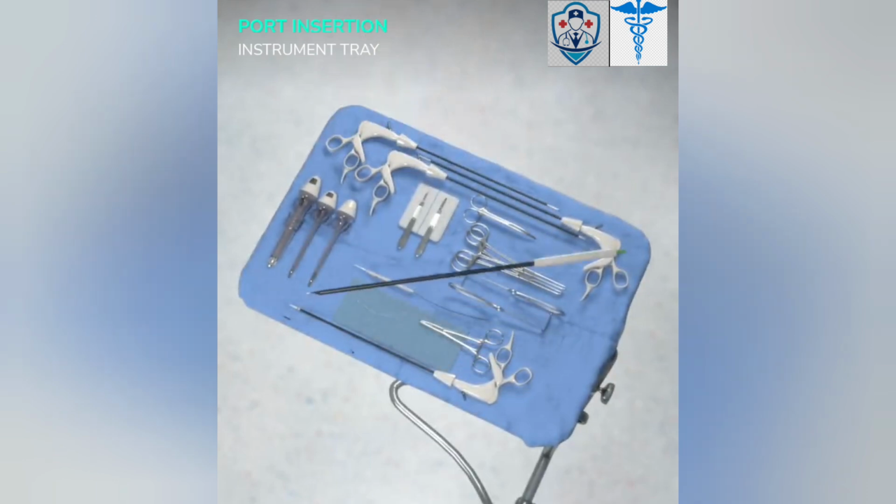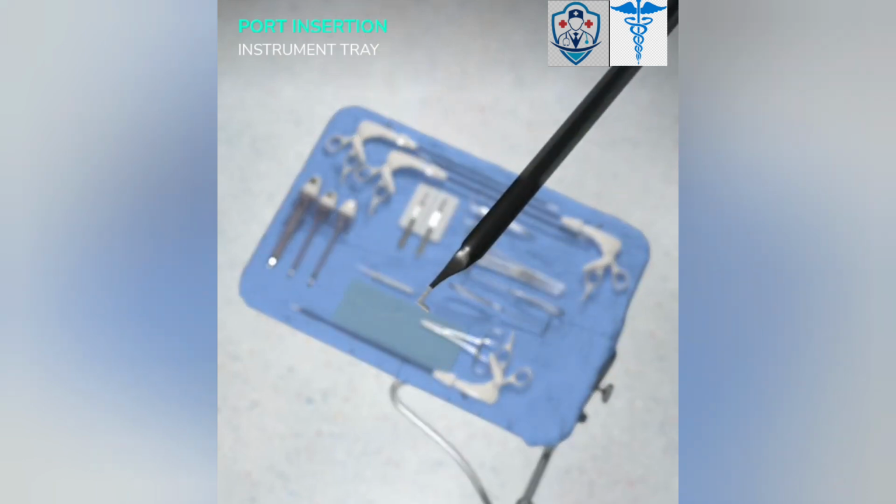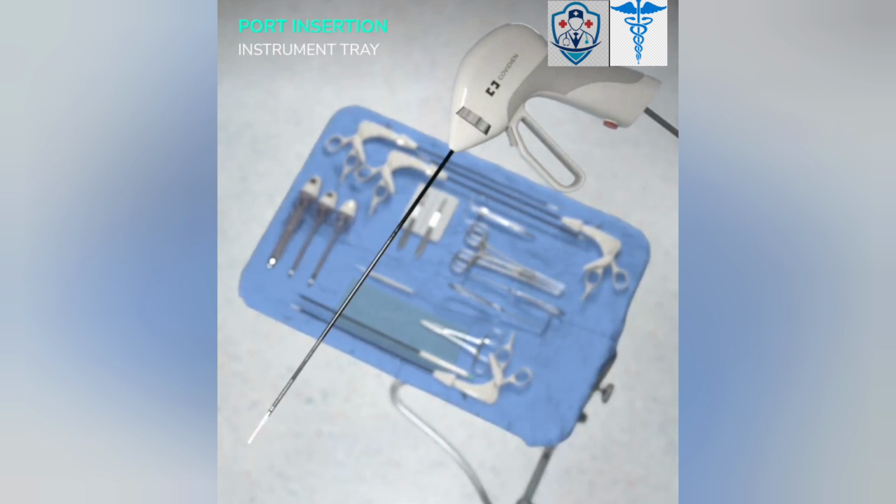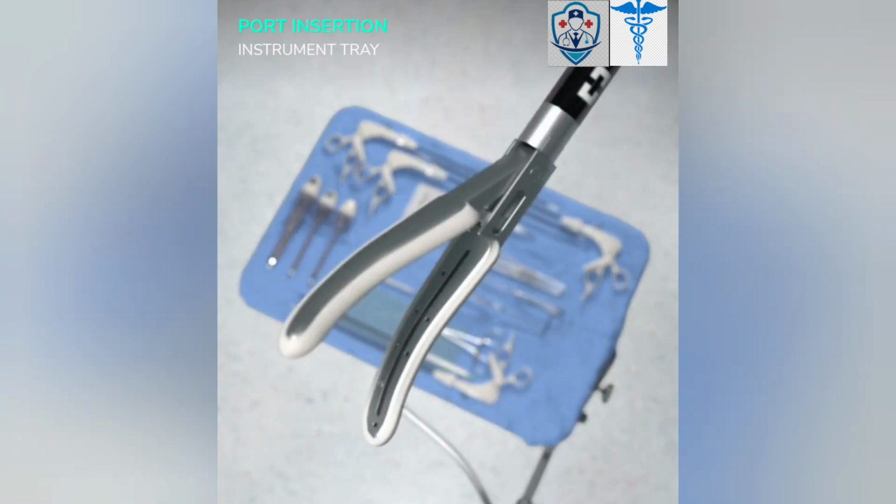The disposable hook has a right-angled tip. The hook can be used to cut or coagulate using different voltage outputs. This instrument is commonly used as the general dissection instrument in laparoscopic appendectomies. Another energy device can also be used as an optional instrument in this procedure, depending on the surgeon's preference to grasp, cut, dissect, and seal tissue in vessels.